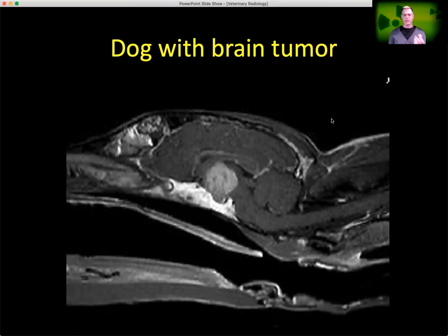And so we did an MRI image of this patient, and we actually injected a contrast material, which allows different structures to change the way they look on the image based on how much of that contrast material goes to those particular sites. It tends, however, to localize where there are sites of lots of blood supply, because it is in the blood. And so where there's a vigorous blood supply, we tend to see this contrast agent collect.